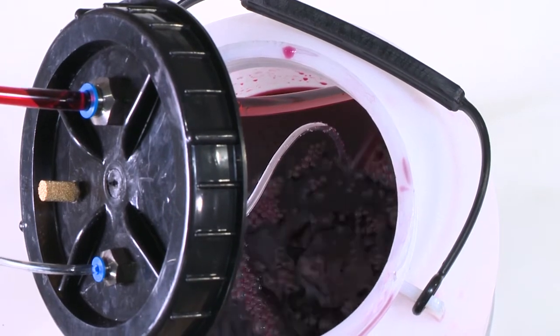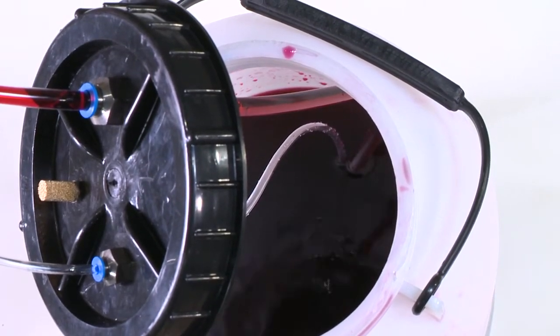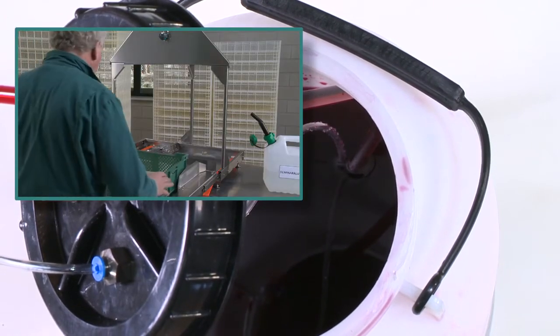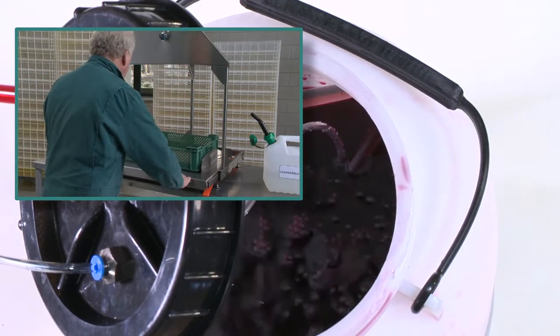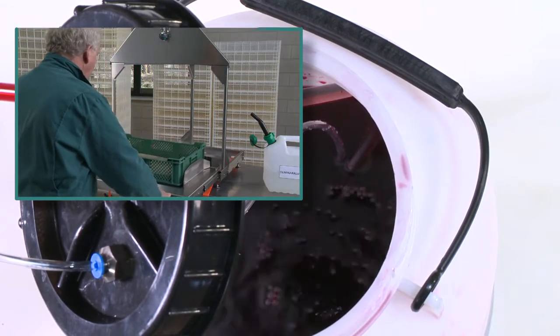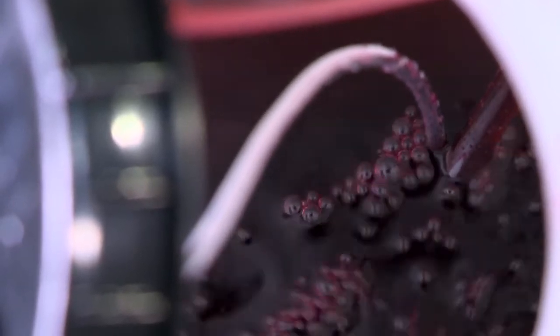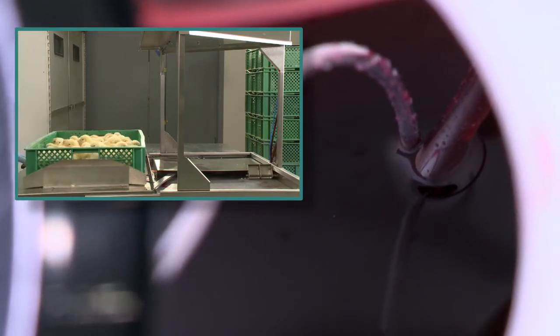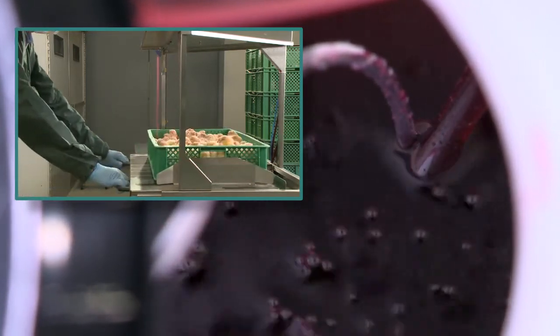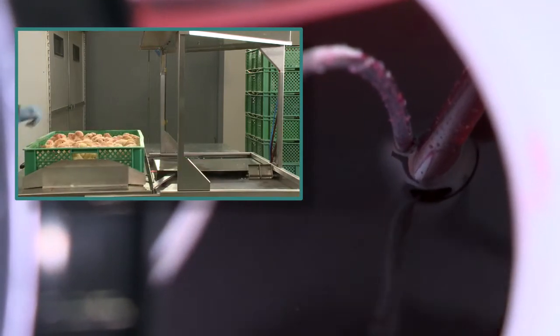Coccidiosis vaccines do not remain stable in a solution. Therefore, the vaccine has to be agitated during vaccination. The Nobilis Spray is equipped with a system that supplies an amount of air to the bottom of the vaccine reservoir. The air gets delivered with every piston stroke made with the vaccinator. This airflow prevents sedimentation of the vaccine and ensures an even distribution of the coccidiosis vaccine onto the day-old chicks.